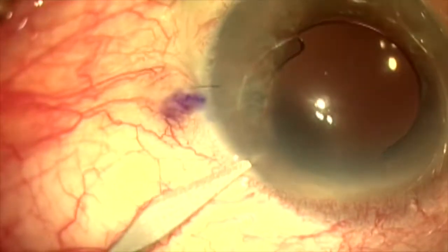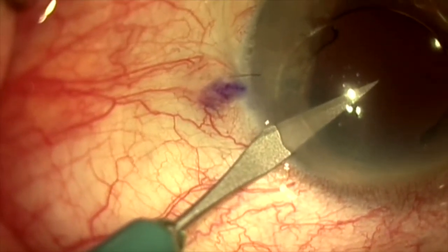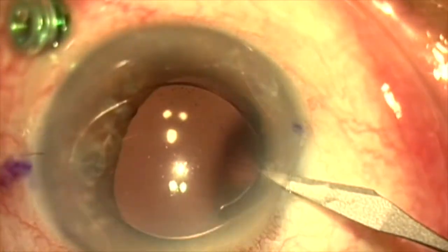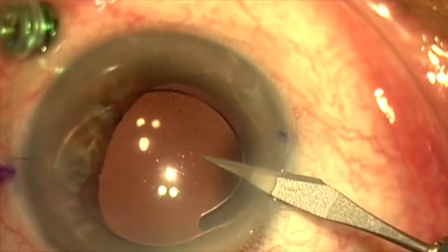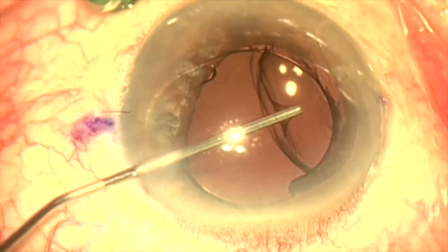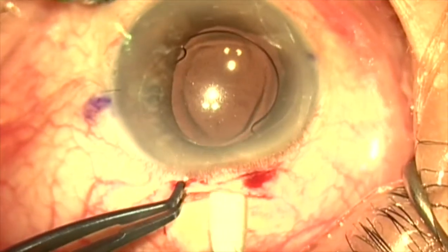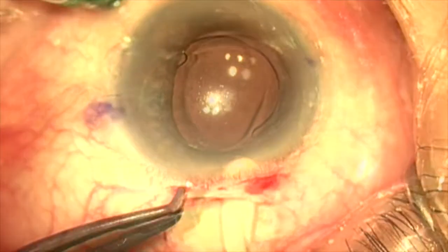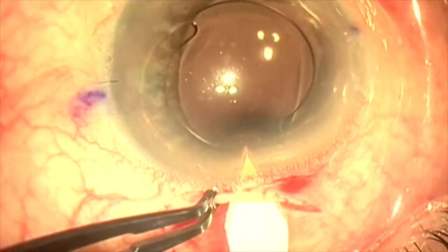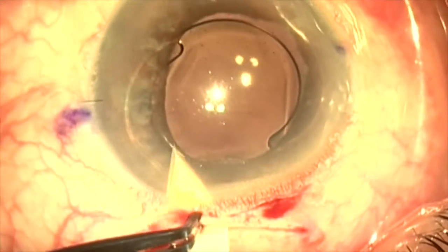We've started the case by placing a pars plana trocar already, and now we're making our paracentesis on each side. We're going to put dispersive viscoelastic over the anterior chamber lens to stabilize the anterior chamber and to protect the cornea endothelium. We're making a self-sealing scleral tunnel incision on the patient's steep axis, as he has over two diopters of astigmatism.